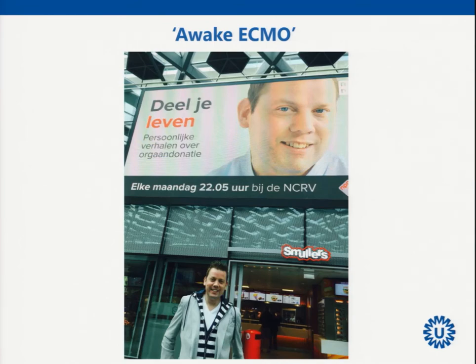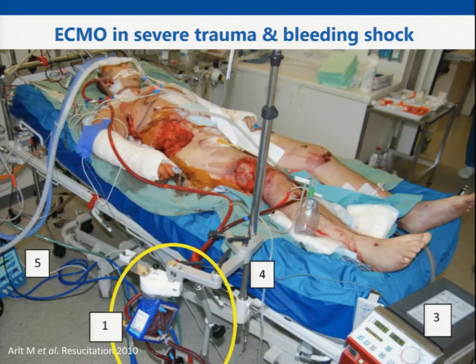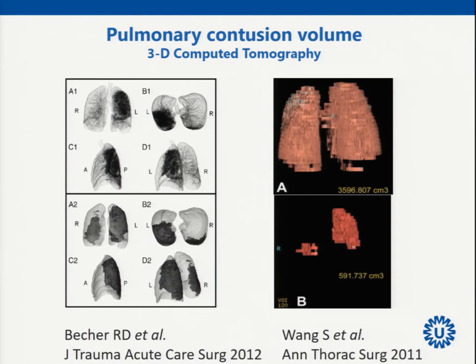But you can see that you might be able to manage it. It's 50-50 in our experience, so 50% of the patients that are bridged with awake ECMO will ultimately survive to successful transplantation. Some people think that ECMO might also be useful in trauma, lung contusion.